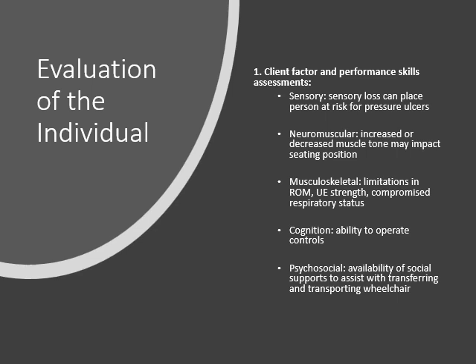Looking at cognition, does the person have the ability to learn how to operate the controls? And then the psychosocial environment. So is there social support to help with transferring and transporting the wheelchair? So you can get a person the fanciest, most beautifully designed, well-fitted wheelchair, but if they can't get it through the doors of their home, then what's the point?